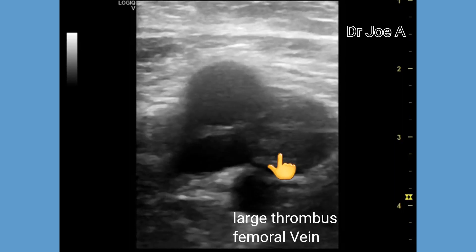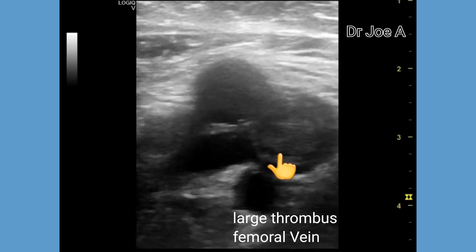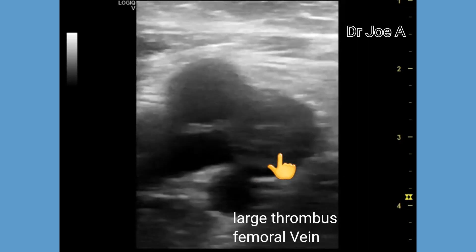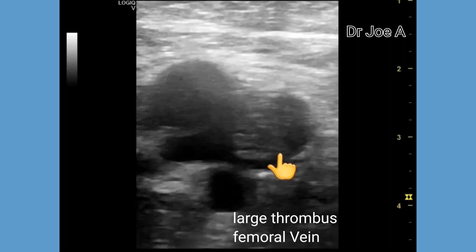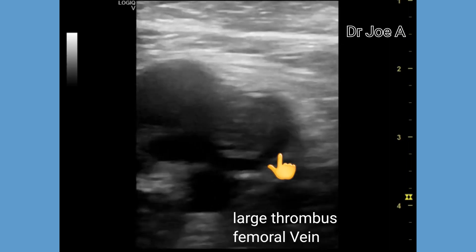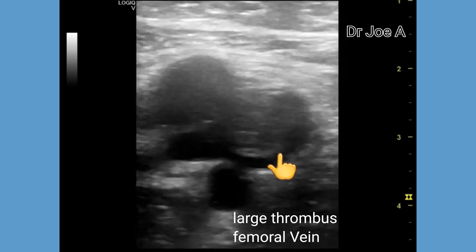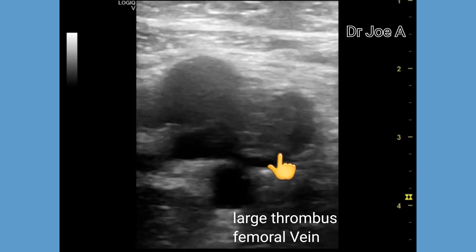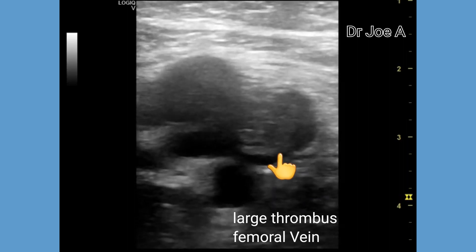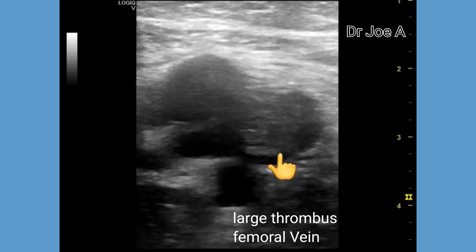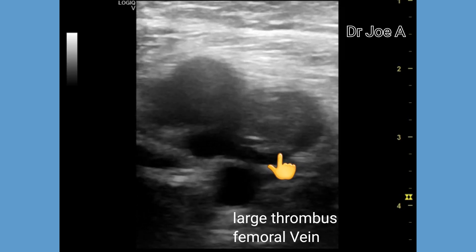The femoral vein is seen medial to the femoral artery on cross-section. There is near total occlusion of the femoral vein as seen in this cross-section, with the thrombus seen bulging into the lumen of the femoral vein.